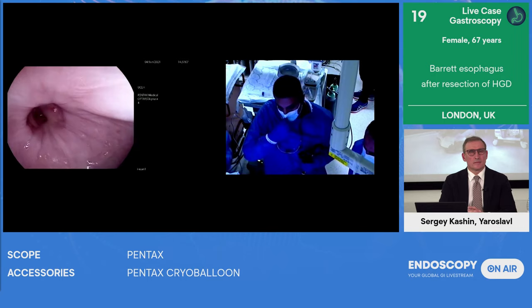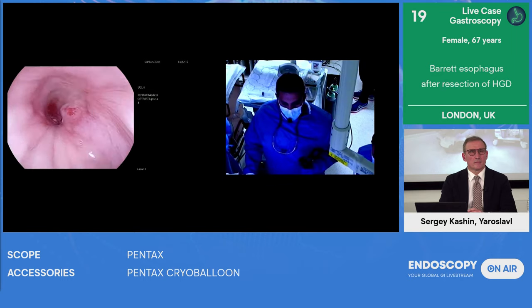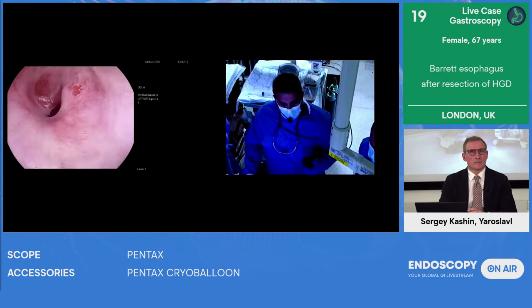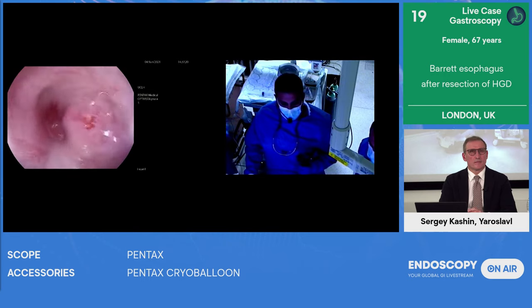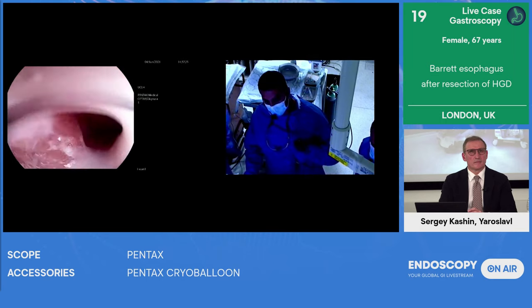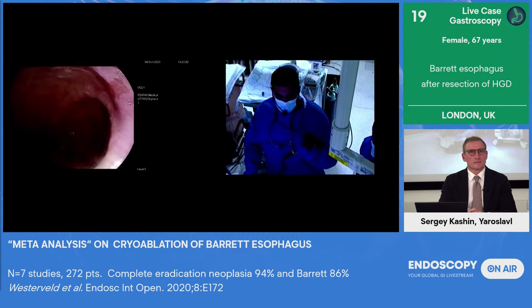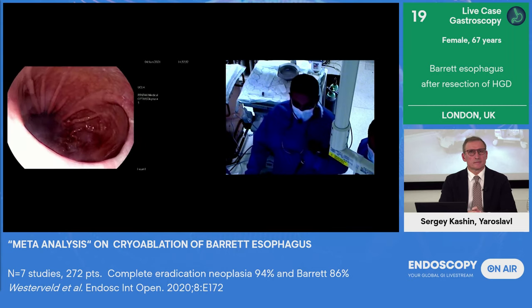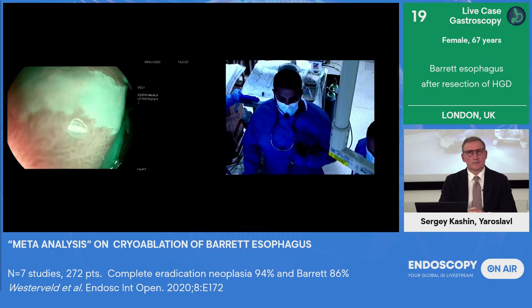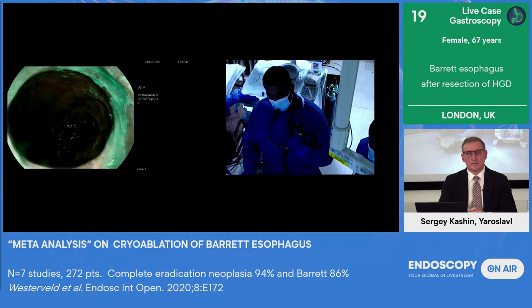So I've got Vinay Sehgal here, one of my consultant colleagues. So you can see here, ladies and gents, you've got a pretty sorry looking esophagus because of what we've done to it. There's a lot of scarring here on the posterior wall from the endoscopic resection. And then you've got an asymptomatic stenosis here, which then sort of curves across to the right into the top above a massive hiatal hernia like a lot of these patients do. So if I now switch to the optical imaging that these scopes give us, this lady had 5 centimeters of Barrett's at her last treatment.